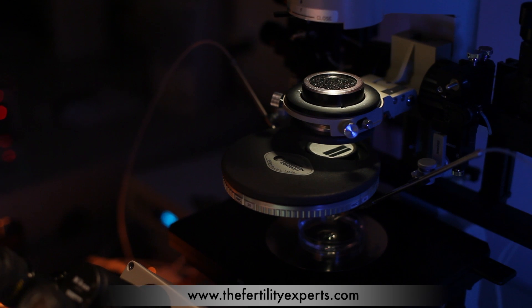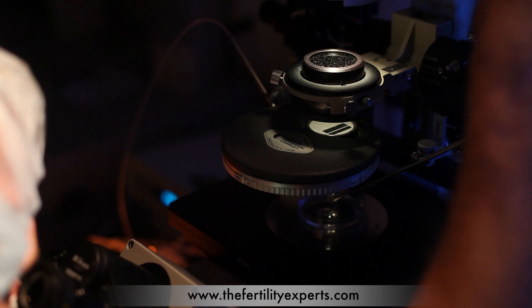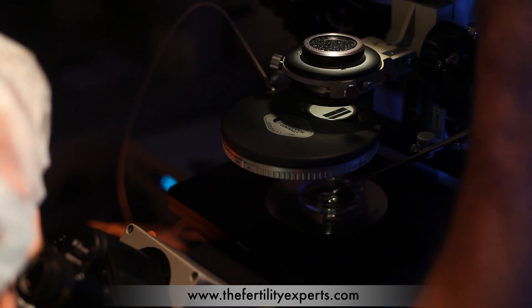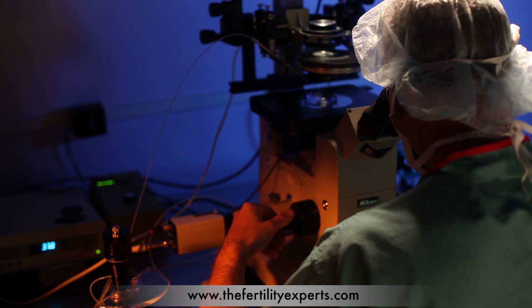The needles are lowered into the dish and rechecked for alignment. Once the dish is secured on the microscope stage and the needles are properly aligned, I begin by selecting a morphologically normal sperm exhibiting good forward progression. The ICSI needle is gently dragged over the tail of the sperm, stunning it and allowing for the sperm to be brought into the needle.